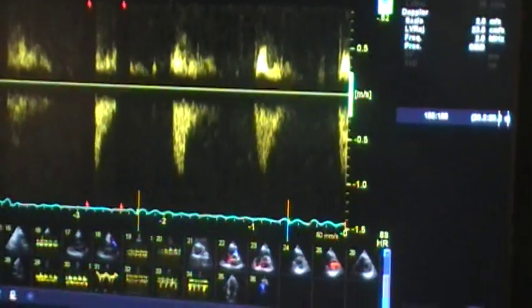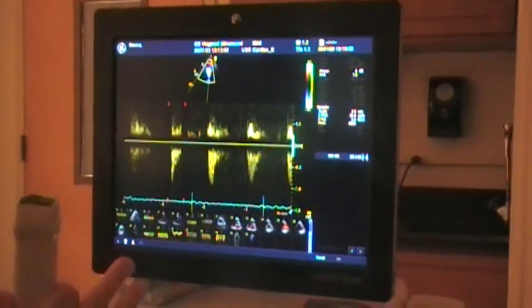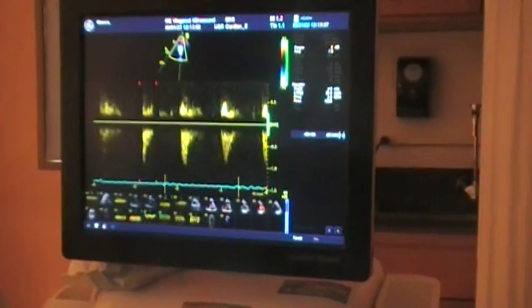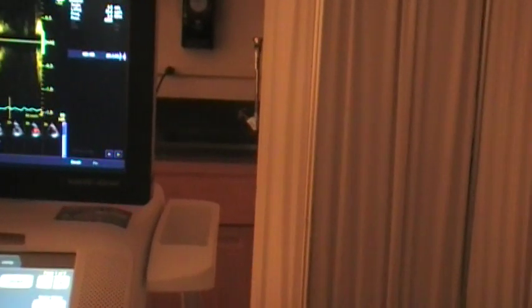The only other thing with aortic arch, if they have aortic stenosis, you need to do that. That's an ASE recommendation. It has to be done. The PEDOF probe, the non-imaging cardiac probe that we use, you'll do it from this view. You'll also do it from right sternal and then apical. But that's something you really have to practice. It's just getting the highest Doppler of the aortic valve usually. All right, and that's a whole complete echo. Any questions?